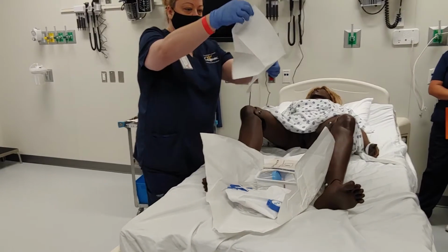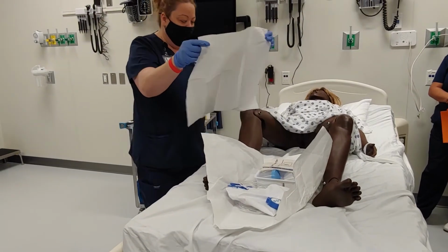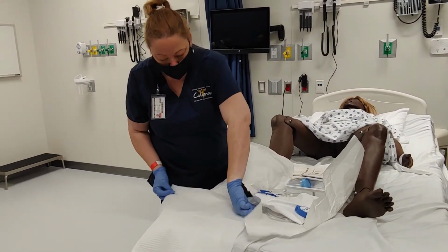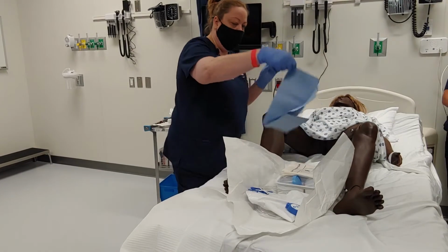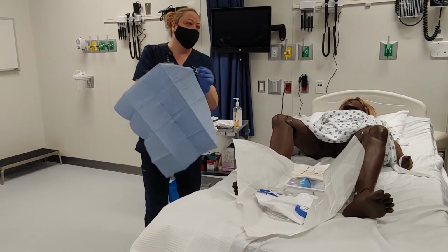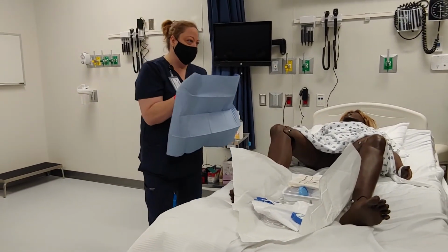Okay, this drape is just going to go under them, okay? Actually off to the side here because that's where I'm going to set my stuff. This next one, and again, I'm just picking it up from the very corner. Okay, this is the absorbent towel that's going to go under them because inevitably, at least when you're pulling the catheter out, you're going to have some drainage.